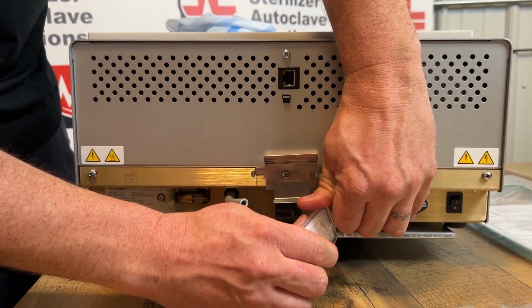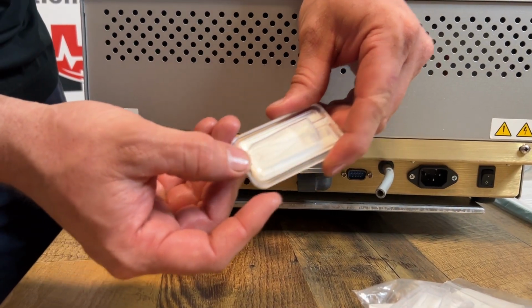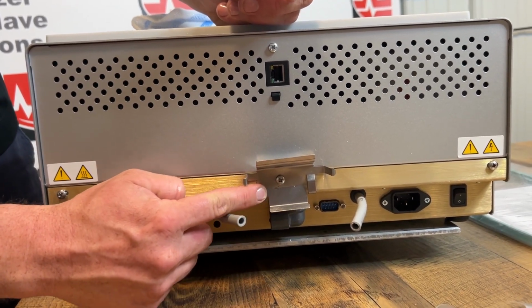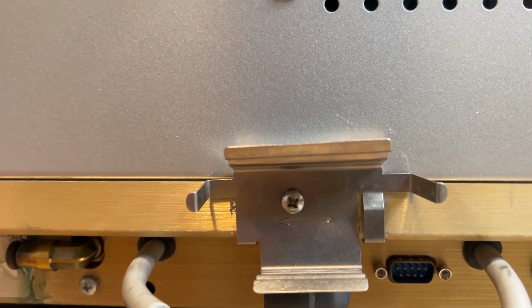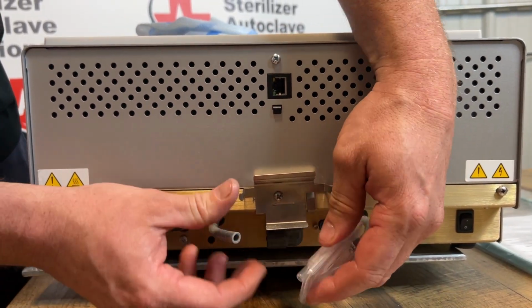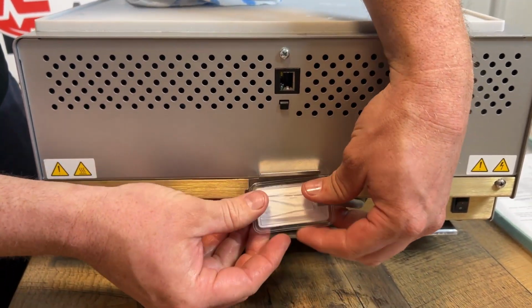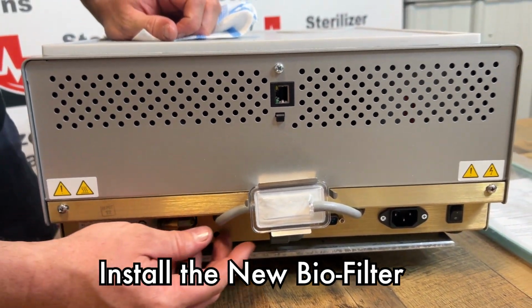These are just connected by tubes. Your new biofilter will have the same arrow, and if you look on your bracket, there's actually an arrow on the bracket as well. I'm going to take the new biofilter and slide it on both tubes, and I'm going to push up on the top and push in. That will hold that in place.